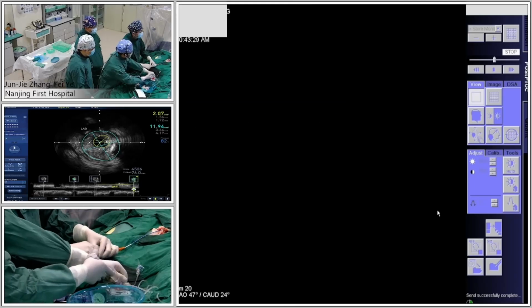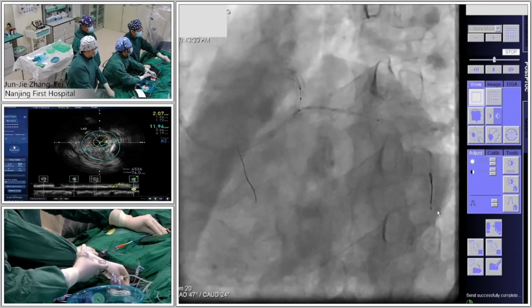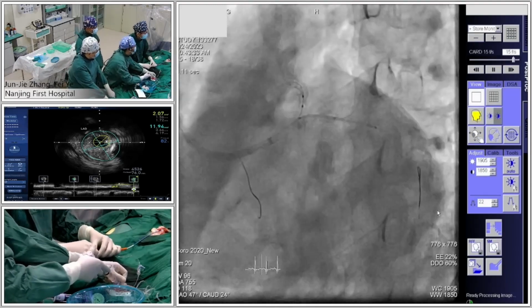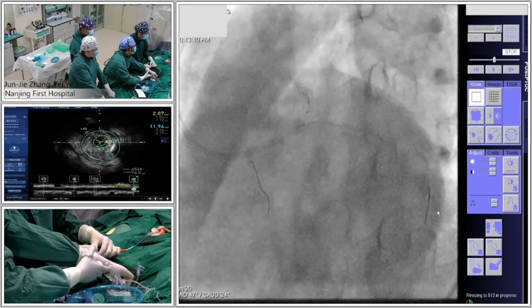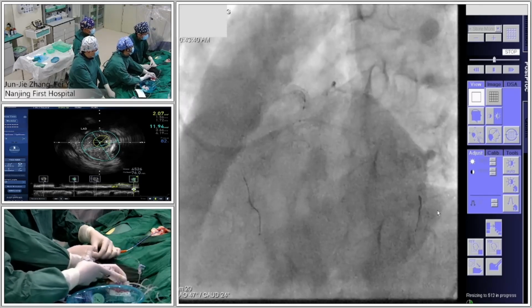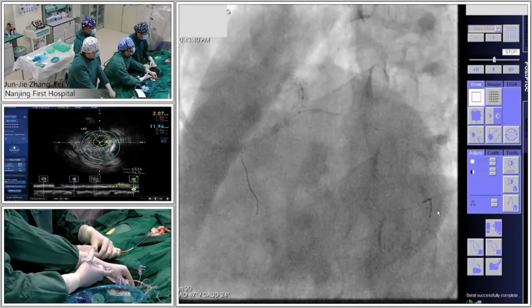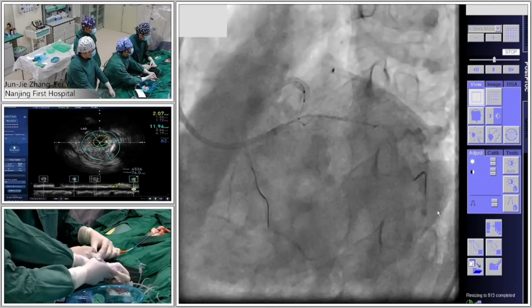So in terms of a DK crush, I think Dr. Ye, you are the master. What protrusion into the left main do you want for the circumflex stent? One to two millimeters, if it is possible from the angle, we can find it clearly. Okay, put it back. For the distal, you were just before the first obtuse marginal branch. Yes. Okay.